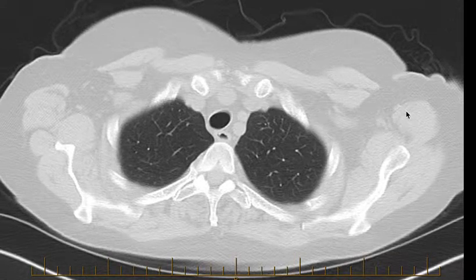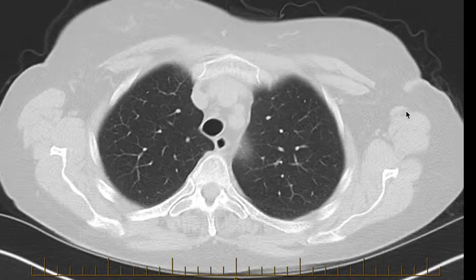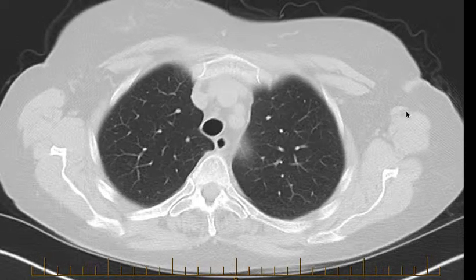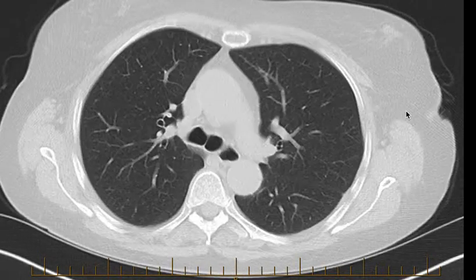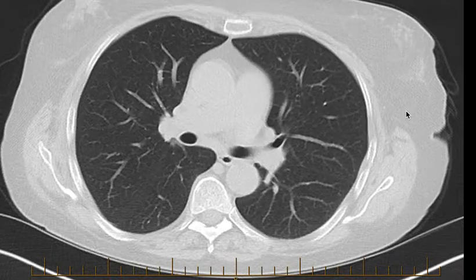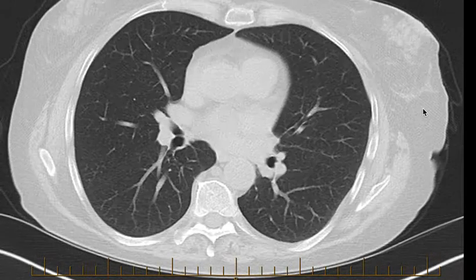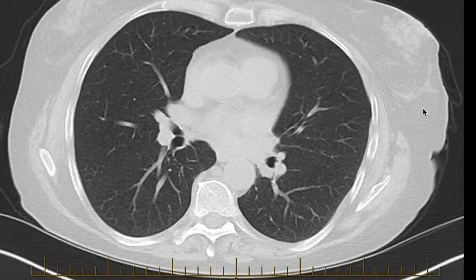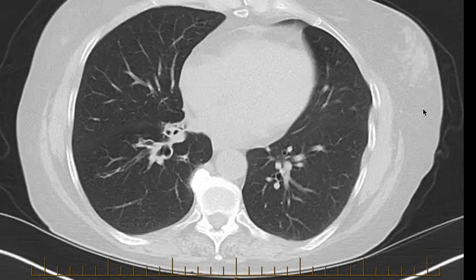Here we have a CT scan of a patient who I've been asked to do bronchoscopy for. I'll just scroll through — you can see the upper zones of the lung look completely normal here. Normal looking airways, central airways are clear, no interstitial lung disease, no bronchiectasis.